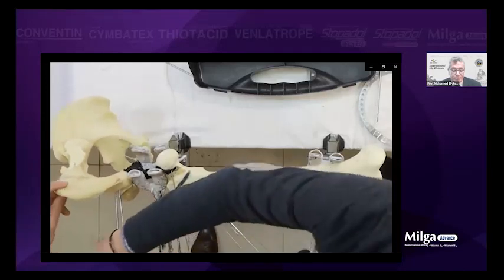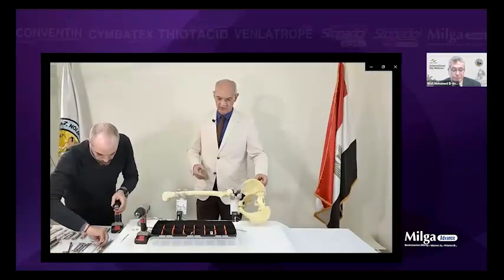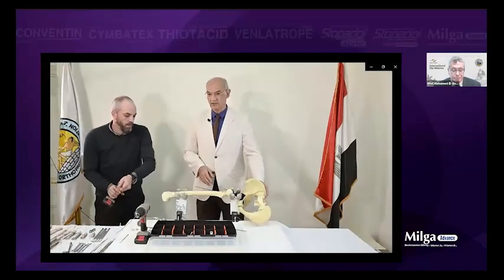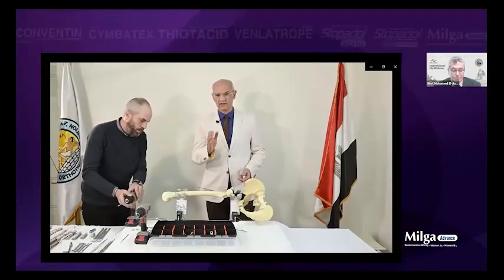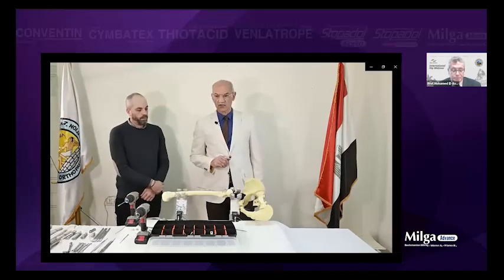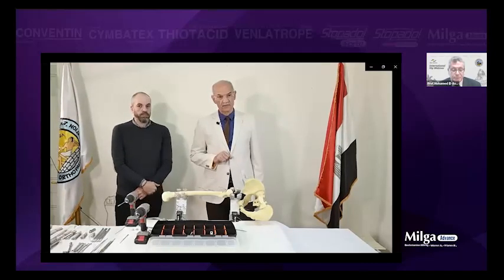Again, yes, okay, that's enough. So this is the 5th method of fixation. So we have 5 methods of fixation. This is the real operation, not the fixator. The problem comes, the people talk about the fixator, and it's not a standard fixator. After you finish application of the wires and half pins, you design the fixator according to this shape.